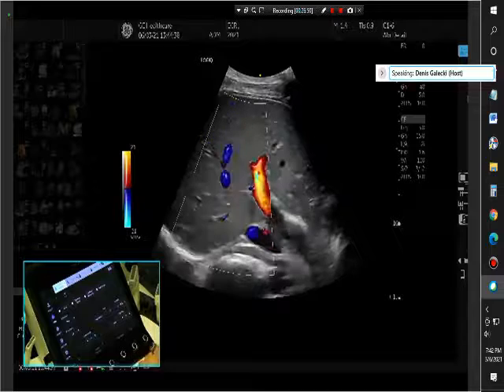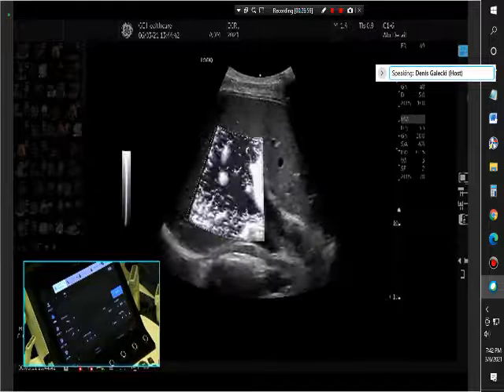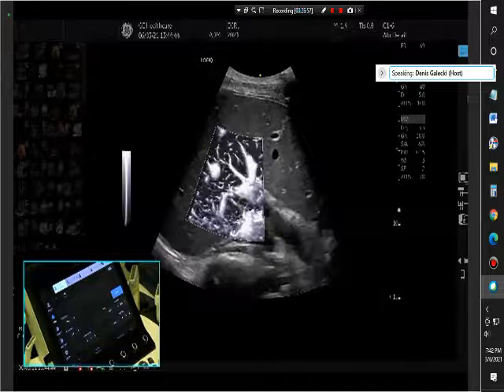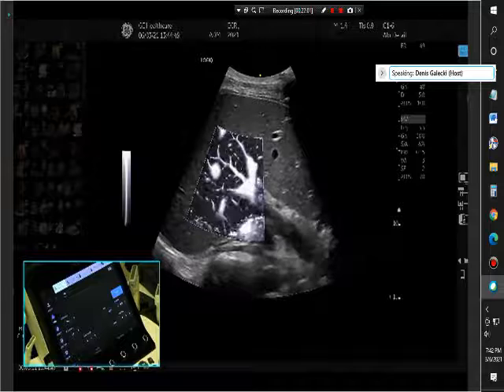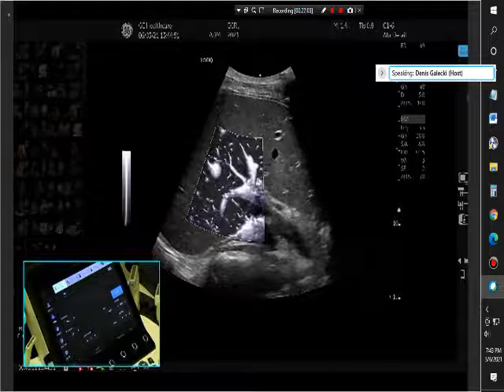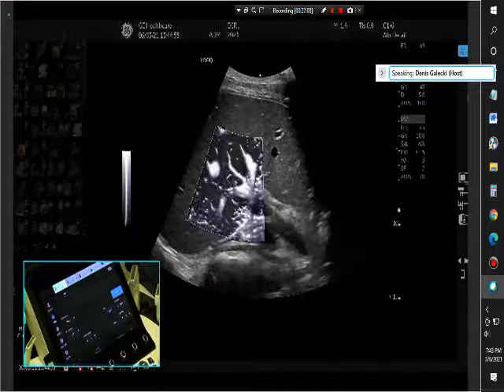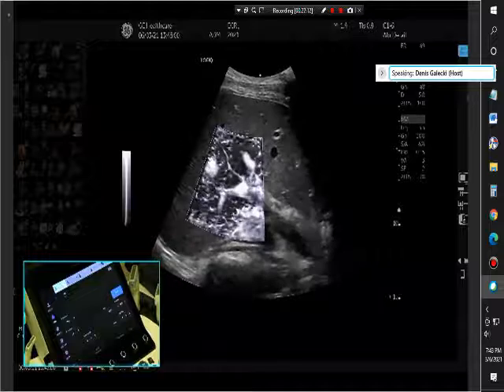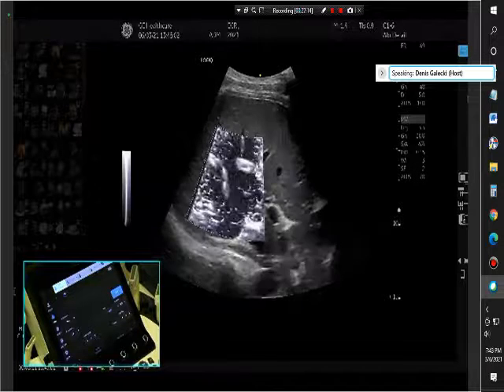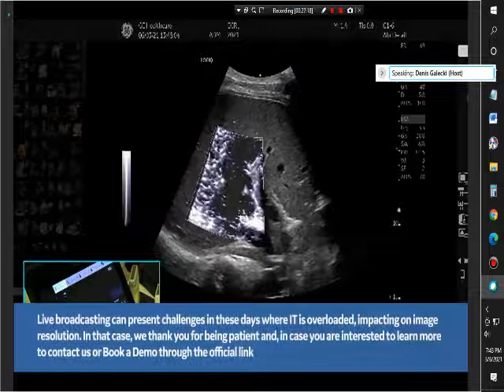Let's enable microvascular imaging. Stop breathing, please. Microvascular imaging is dedicated for very tiny vessels. And you can see here the image in combination with radiant flow, an algorithm which provides you a 3D appearance and increases the definition of vessel borders. Okay, breathe out.